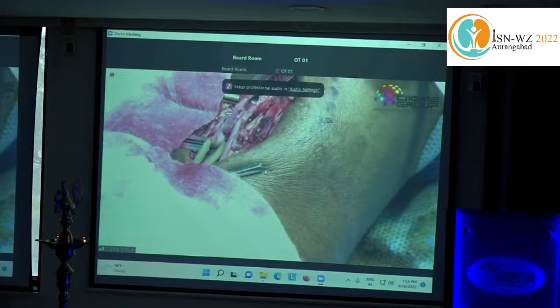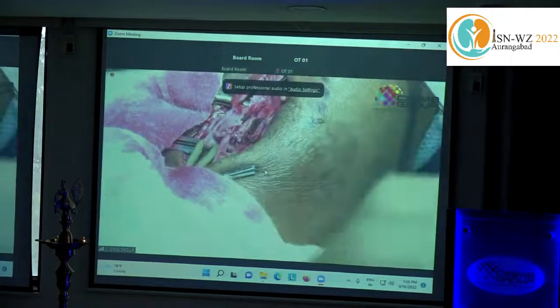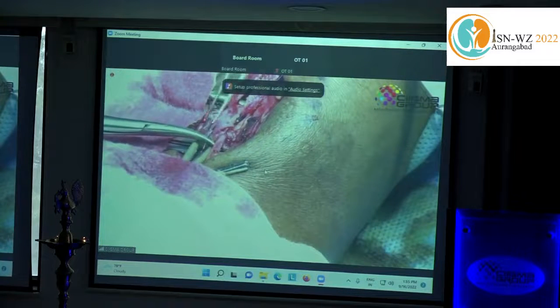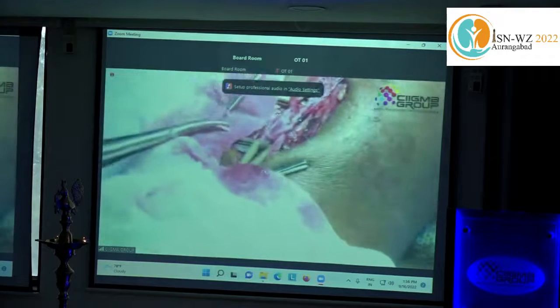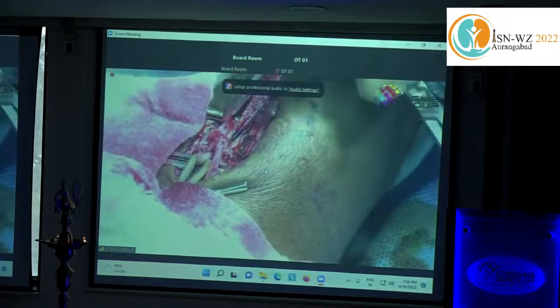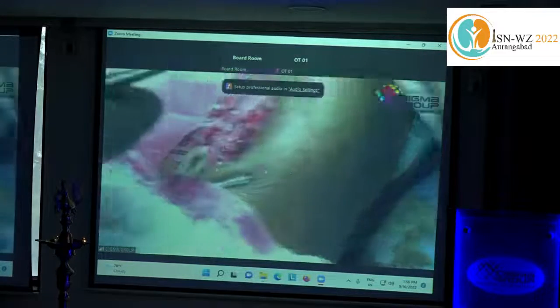Now you need to be careful about the corner, like the last one from this side of the wall. If you have doubt, better put in your vascular forceps, no other forceps, only vascular forceps, and do the suture under vision. So here I am done on this side. All sutures should be under vision, with no posterior wall, because it is pointing on the anterior wall. So I will stop here because I am not able to visualize if I continue on this suture. So I will go with the other arm which I left previously.